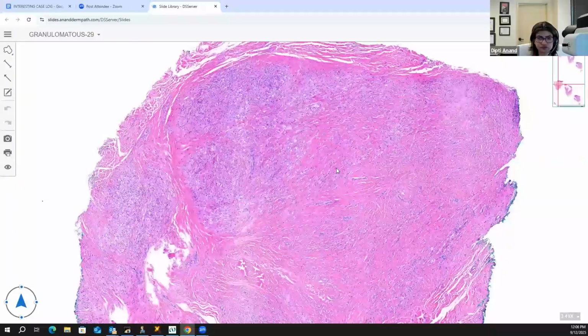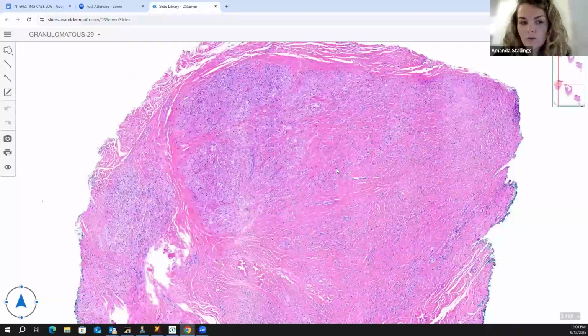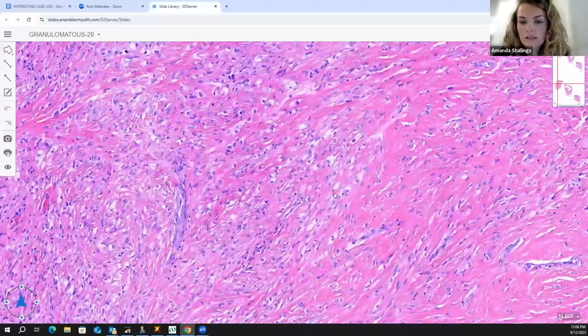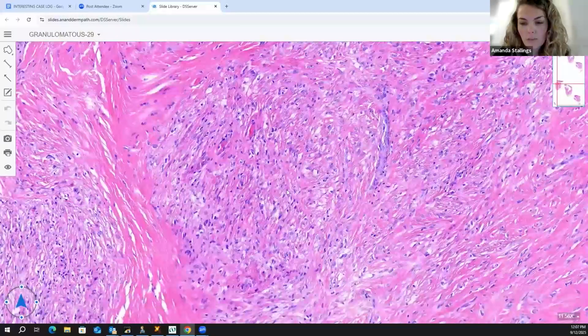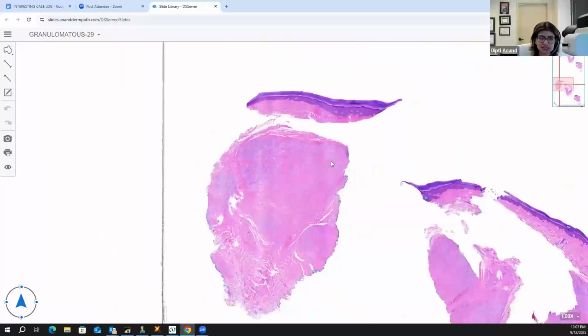We have a deep dermal capsule on acral skin. It's very well circumscribed. And if you zoom in, you can see some cholesterol clefts and foamy histiocytes. So tuberous or tendinous xanthoma. Tuberous or tendinous xanthomas, they're classic, right?